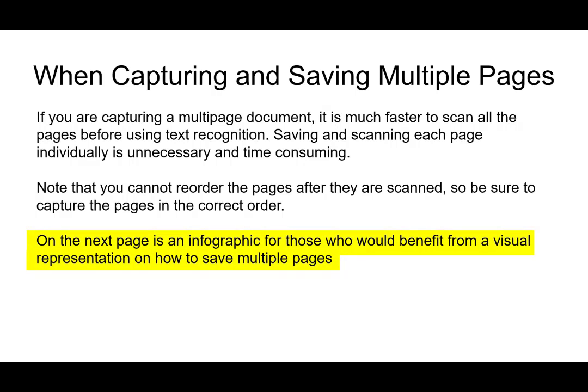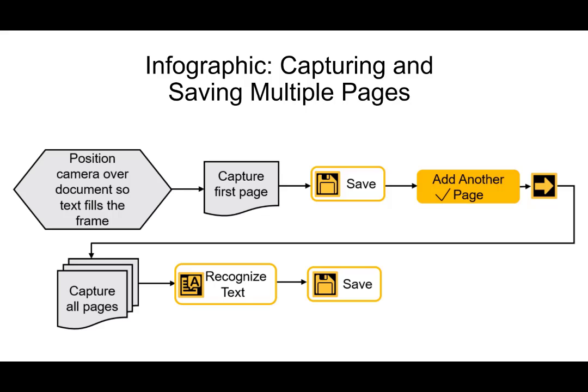On the next page here is going to be a short infographic for those who benefit from a visual representation on how to save multiple pages. So this infographic was pulled directly from the user guide for the Juno, and it's of saving multiple pages. I'm just going to walk through it.